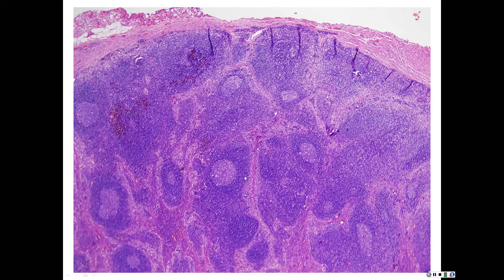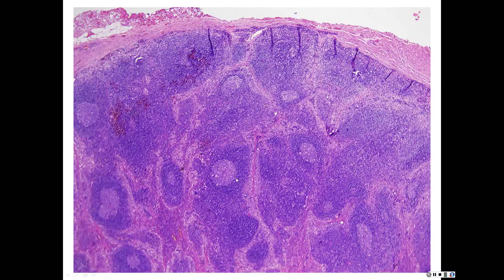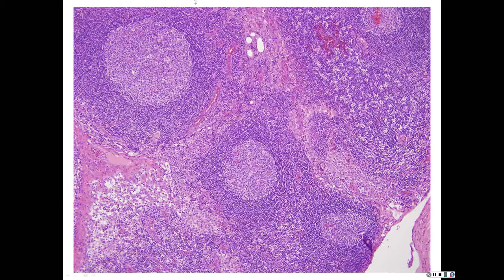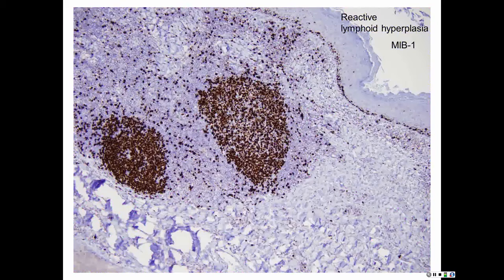When you look at this, this is all mantle; the marginal zone you're not really seeing, and then you see the follicle center. This is sinus histiocytosis, which you get in a lot of reactive nodes. You also get a little bit of a gray layer here sometimes, but it's very hard to see marginal zone in normal.